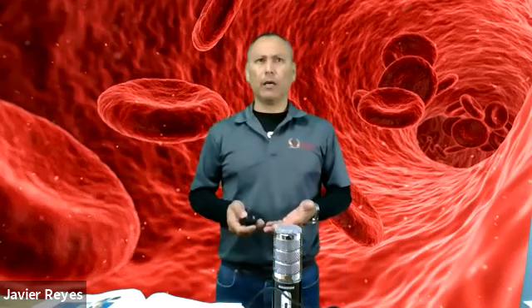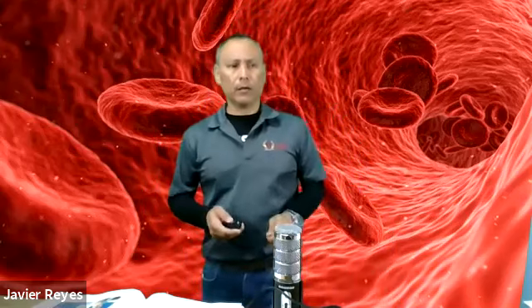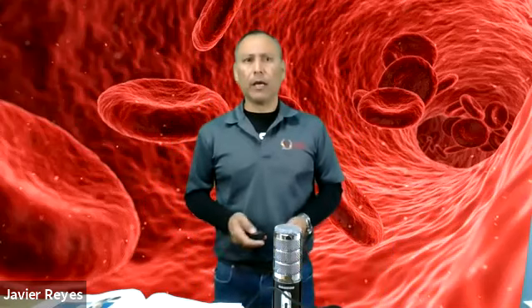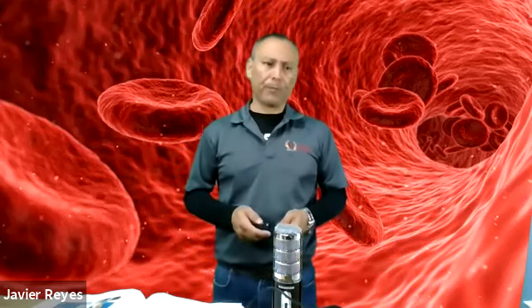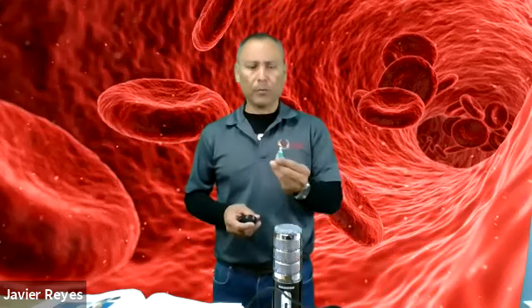All right, so we've introduced ourselves to the capillary puncture equipment. We've seen some of the equipment that we're going to be using. Obviously, a criterion for a lancet device to be considered a lancet device is that it has to be sterile. All the lancets are sterile, such as the one that we'll be using here.